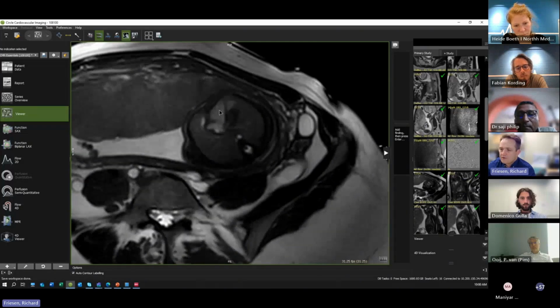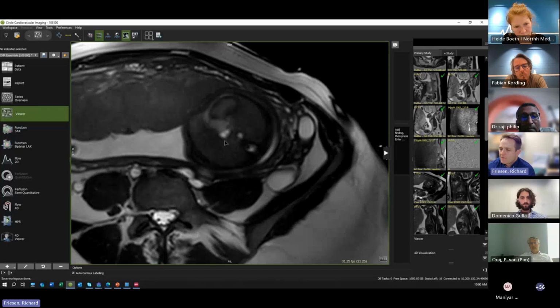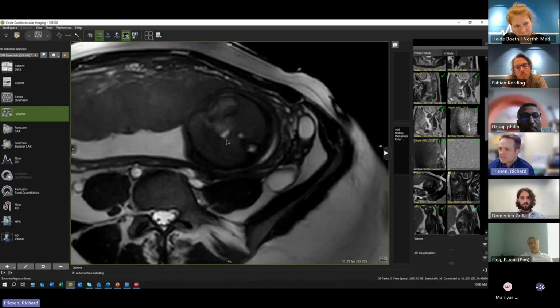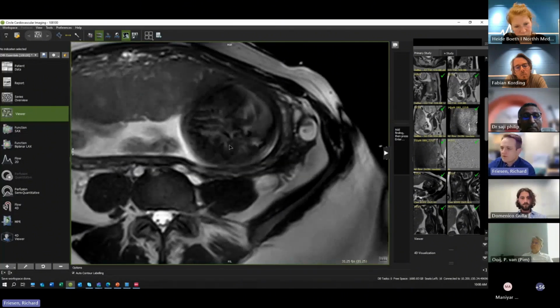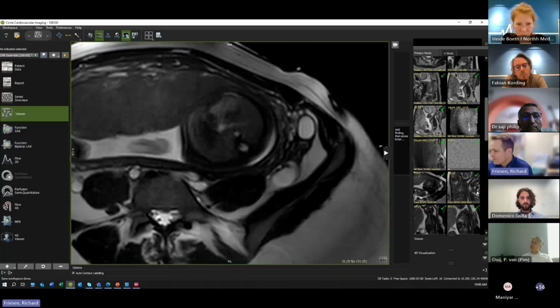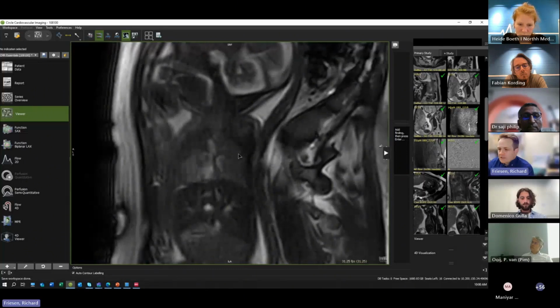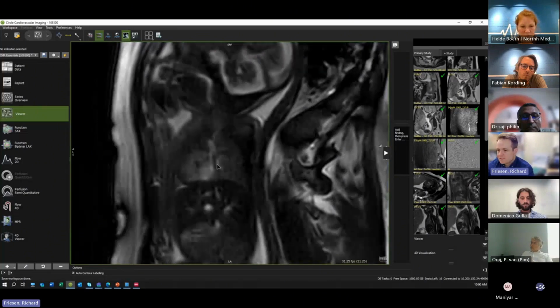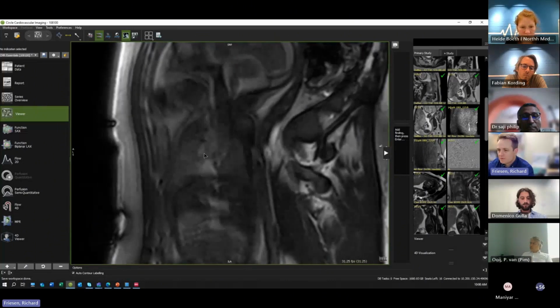As we come down a little bit towards the heart, we see the right atrium, a hypoplastic left ventricle, a dilated right ventricle with normal function. And again, coming down, there's a little bit more artifact and baby motion on this slice, and then we can see our IVC and hepatics and descending aorta coming down a little bit lower. Our vertical long axis, we typically don't have the mom do a breath hold, as we're generally just using it to plan our short axis stack.